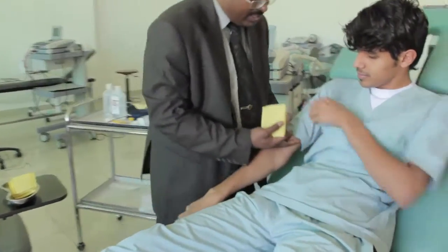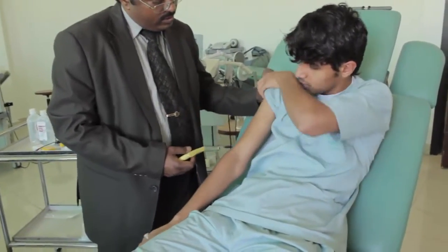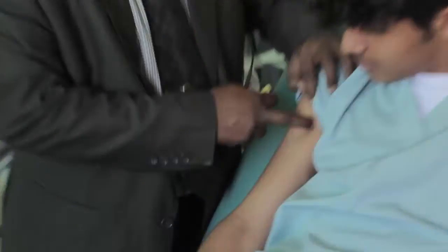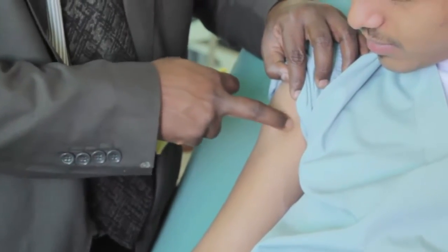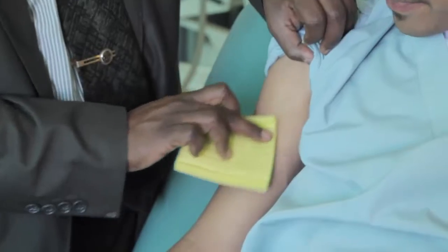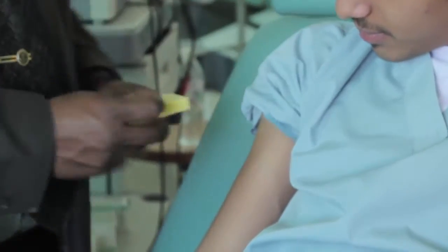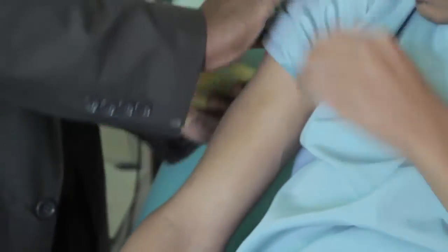Can you lift it? So this is the usual place where they usually get bicipital tendinitis. Can you feel? Okay. So put water in that particular area so that the resistance to electricity will decrease. Even on the opposite side also. Put a sufficient amount of water. Prepare the skin properly.